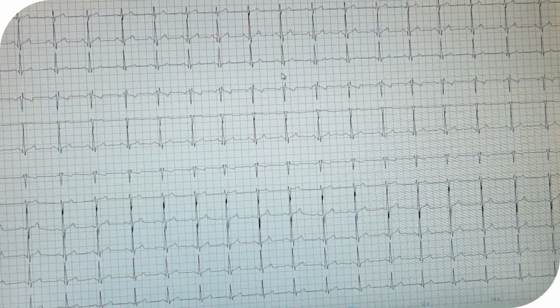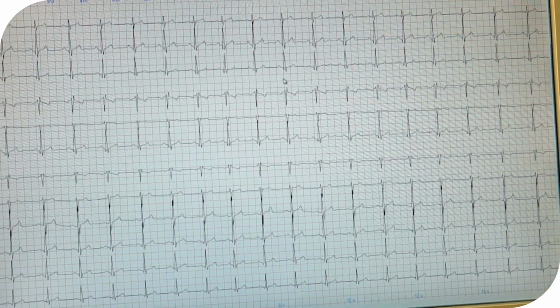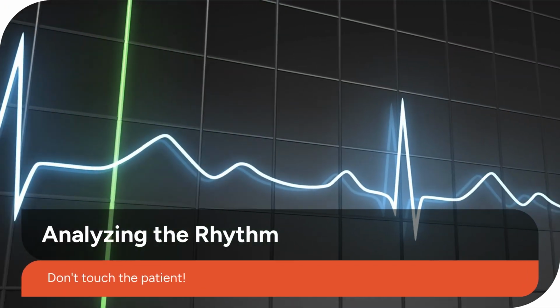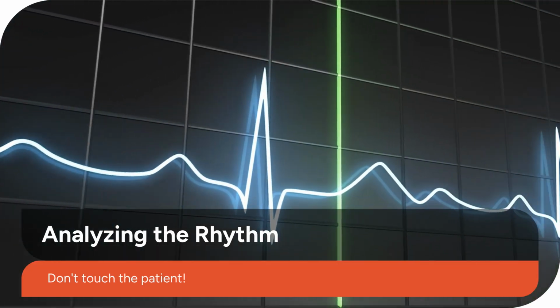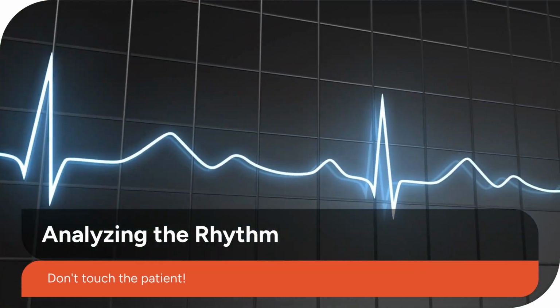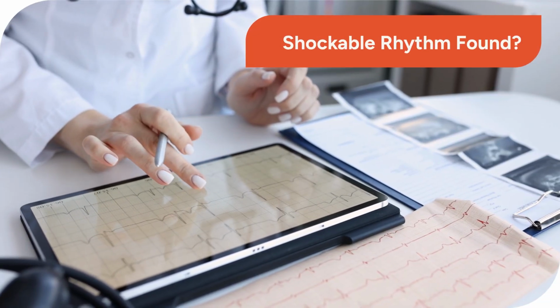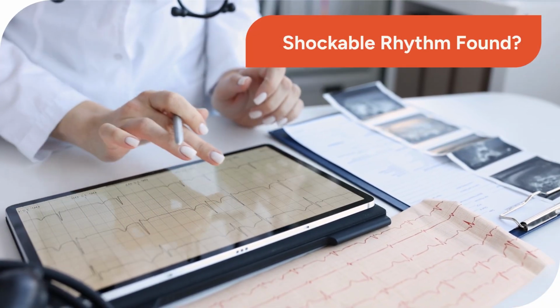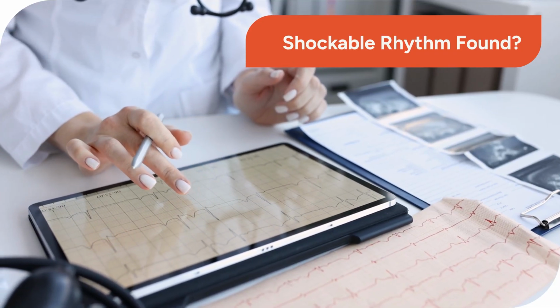Once the pads are securely placed, the AED automatically begins its work by reading the electrical activity of the heart. The AED analyzes the data received from the pads to determine if the patient's heart rhythm is shockable. During this process, it is vital that no one touches the patient. The AED is specifically programmed to look for rhythms like ventricular fibrillation. If a shockable rhythm is detected, the machine proceeds to charge itself.